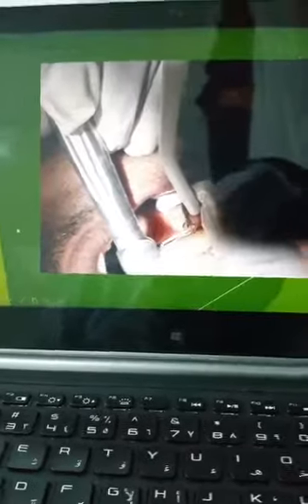This is also a nice tool. You can combine the drill and finish it with the Er:YAG laser to get better healing. This is also useful, because you can use the laser with the crystal tip here, you can use the insert inside. The only disadvantage here is that some companies don't have long tools. I think the maximum is 12 millimeter, and this is one of the disadvantages of using the laser as a drill.